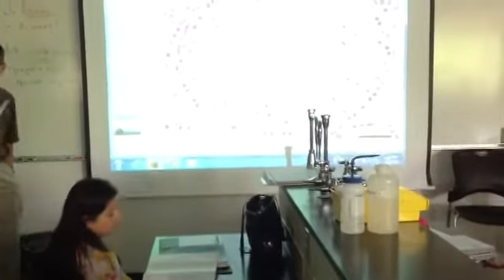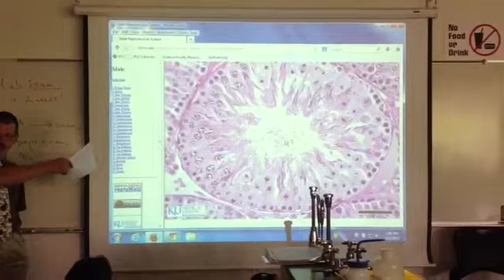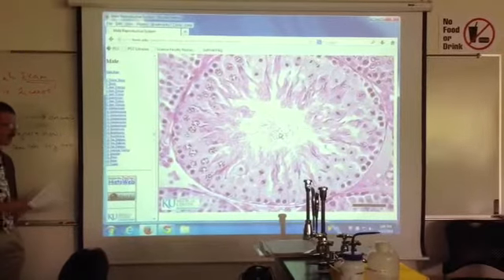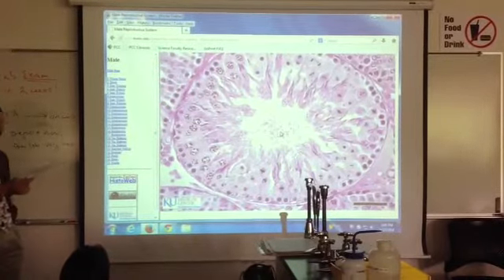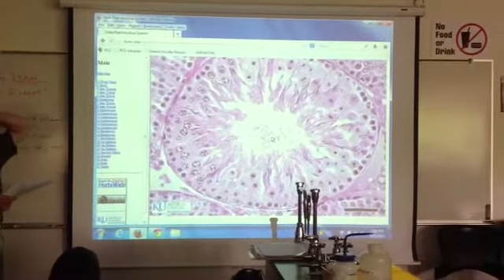The slides. Next week is mostly all slides all the time. So, what is that? What organ is this for your quiz? That's the testis. That's the seminiferous tubule inside the testis. So, you're supposed to review the testis again. You know this. Let's review now some of the cells.